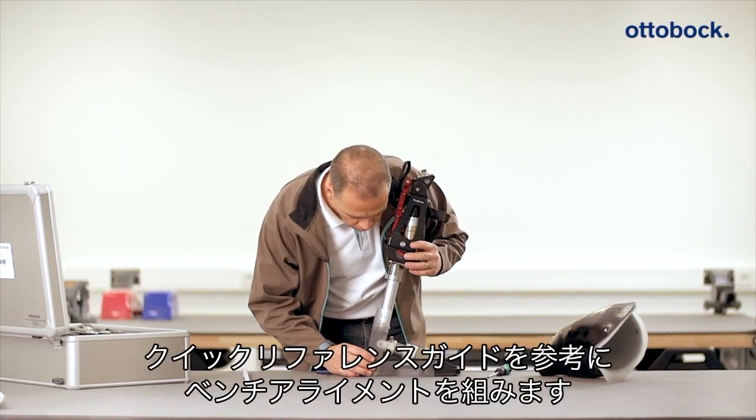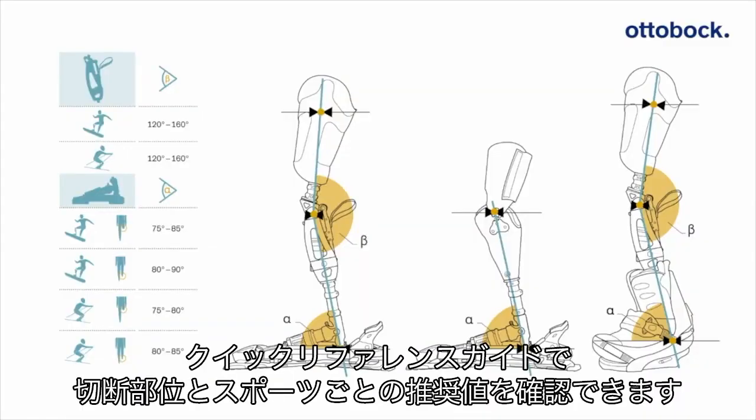The value from the quick reference guide table can be checked with a goniometer and adjusted correspondingly for the selected type of sport and amputation level.